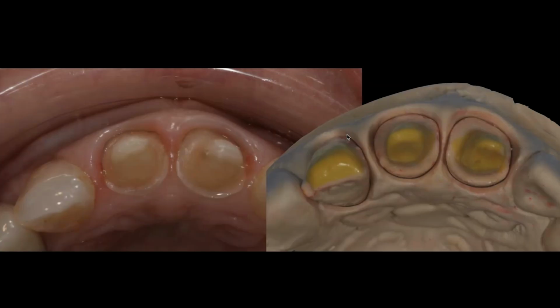And you should be able to look at your cast and start to read through this. What do I mean by that? If I'm looking at these two teeth and I'm going to make restorations on them, well, I can see that this tooth, my line angle is going to be here, and this tooth, my line angle is going to be here. But this one's going to be a challenge. Why? The tooth had an overlap. How do I know? I can tell by the angulation of this root. Look where it kind of comes out to.